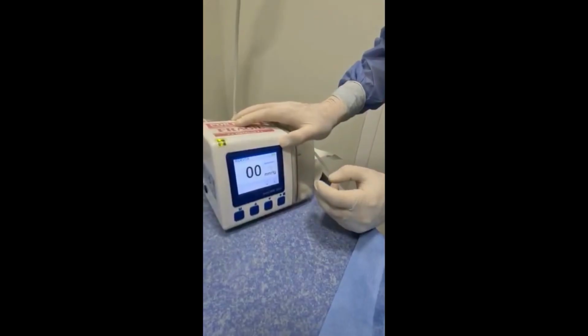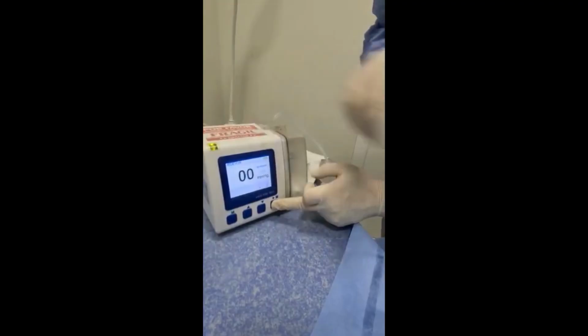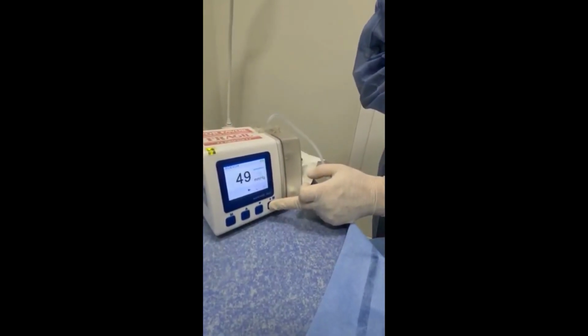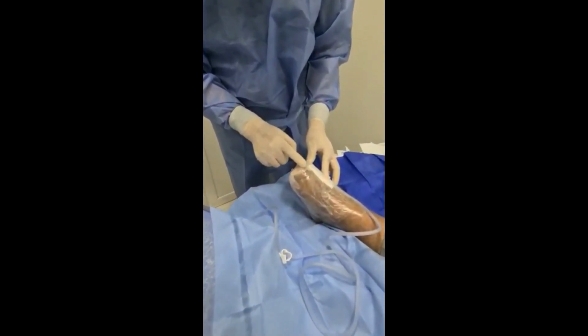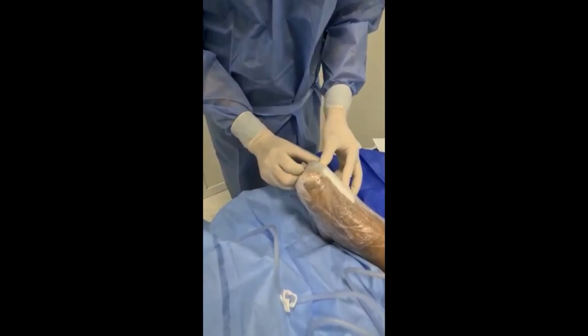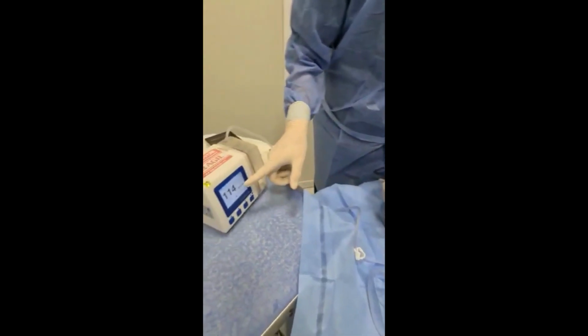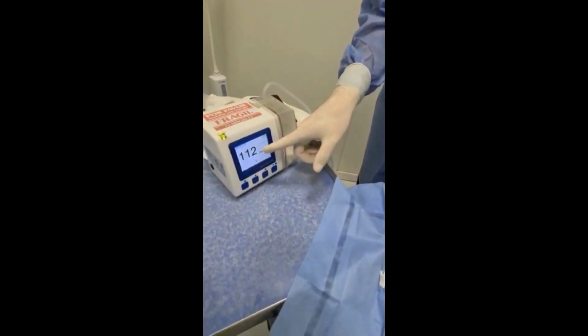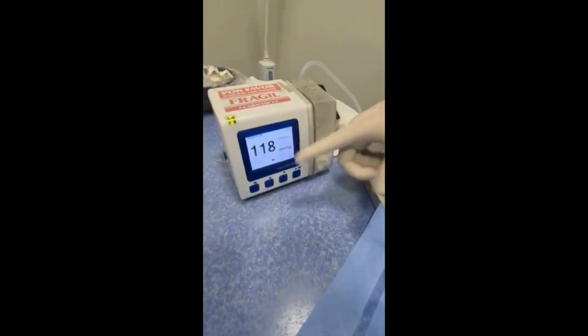Then according to the machine we press for it to start sucking. And here we already have the pressure without leakage because the device did not sound the alarm. And if we look here at the device, it already has its 110 millimeters of mercury of suction.